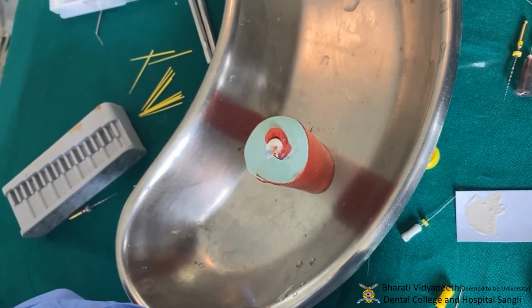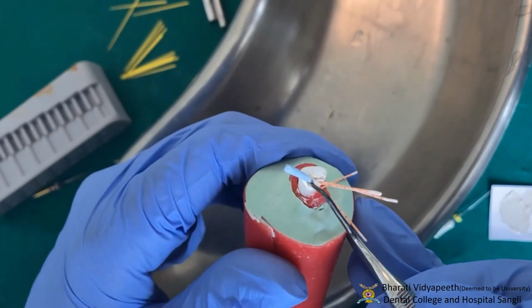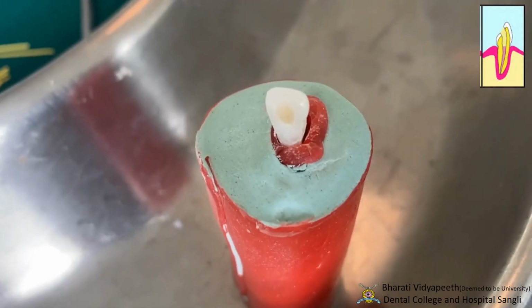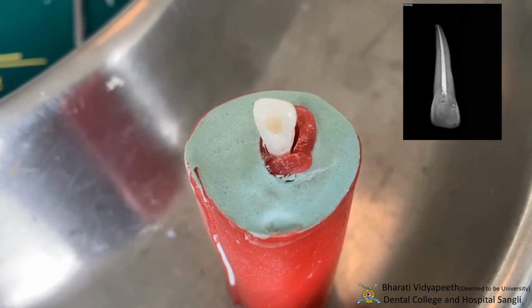The excess is then smeared off with the help of a hot instrument. Following obturation, the tooth is restored with the help of post-endodontic restorative material.